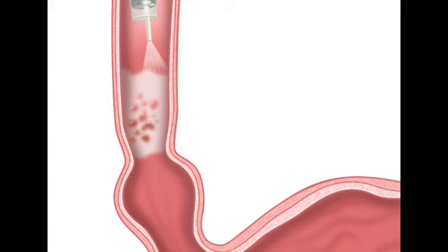Oh, a mist. That makes more sense. Right. And they attach a simple 20 cc syringe filled with the acetic acid to that catheter. Wait, 20 cubic centimeters? Right. That is, what, barely over an ounce of liquid? Yeah, exactly. So we were talking about a very small, very targeted amount. Okay, so it's a tiny amount. A tiny amount, but because it's delivered as a fine mist, it provides maximum surface coverage.